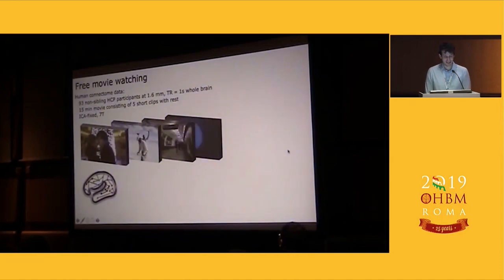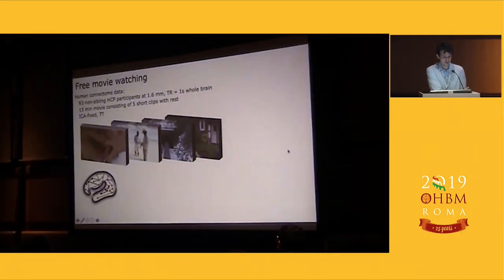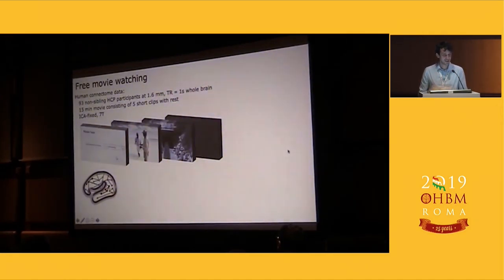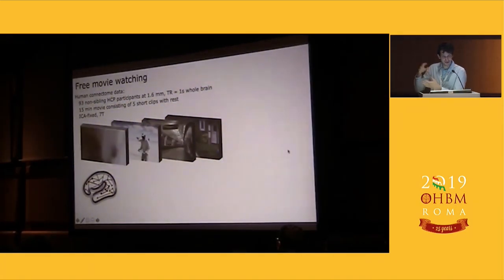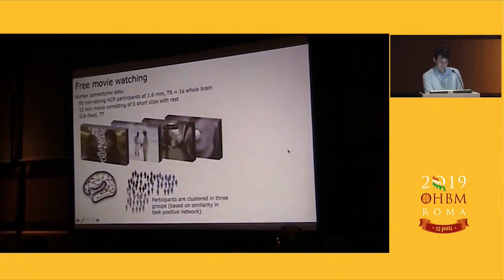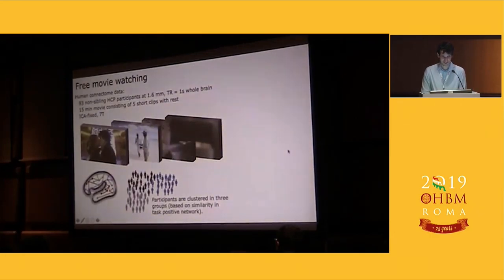Another more neuroscientific application for non-BOLD layer-dependent fMRI that is still fully underdeveloped might be these so-called naturalistic tasks, aka movie watching, which might be very beneficial as a test case for non-BOLD layer-dependent fMRI because they allow us to do any kind of connectivity analysis without this ambiguity of physiological noise-driven fluctuation versus neural signal fluctuations. And in order to approach this new regime, we use the same movies that I also used for the 7T HCP project, meaning that we have about 100 participants already where we know with medium-high resolution what to expect, which kind of signal traces across the different brain areas.